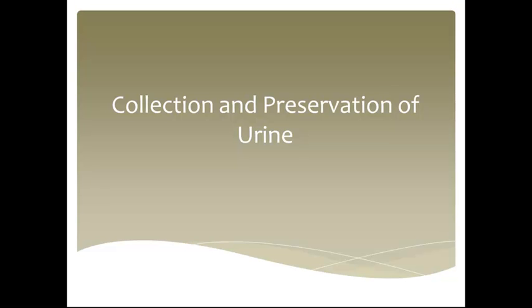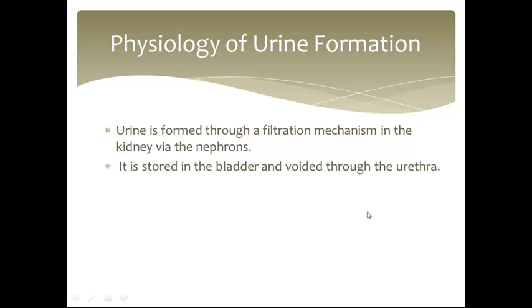Collection and Preservation of Urine lecture. The physiology of urine formation. Urine is formed through a filtration mechanism in the kidney via the nephrons. It is stored in the bladder and voided through the urethra.